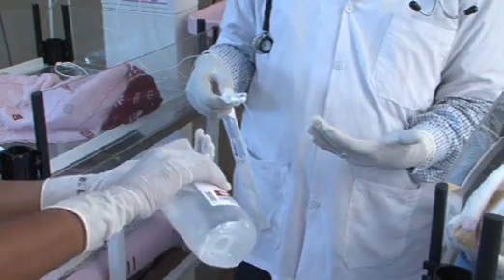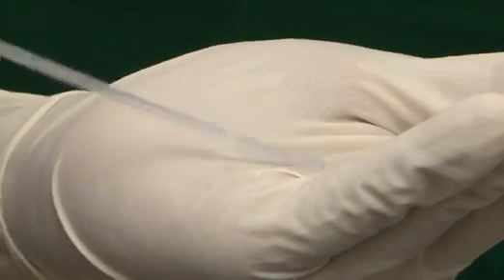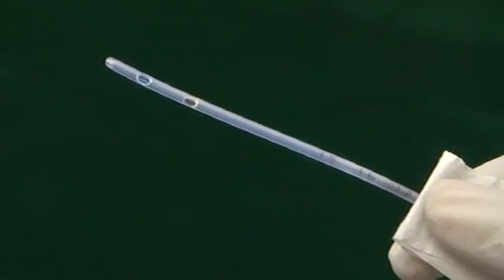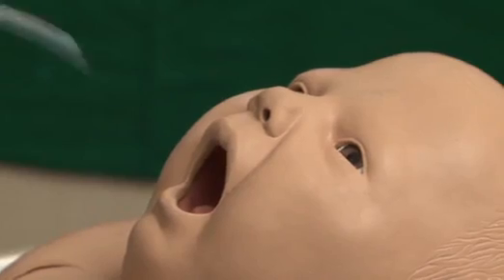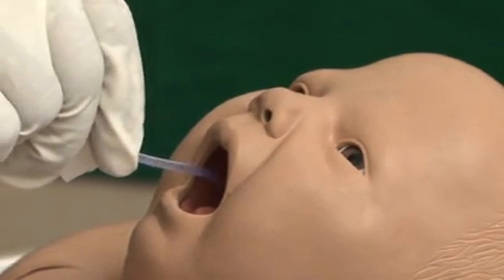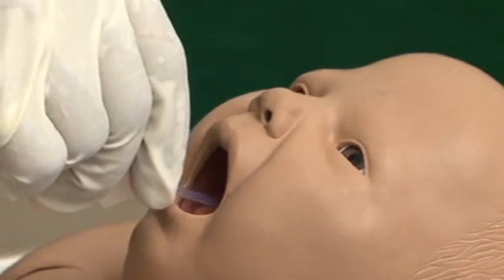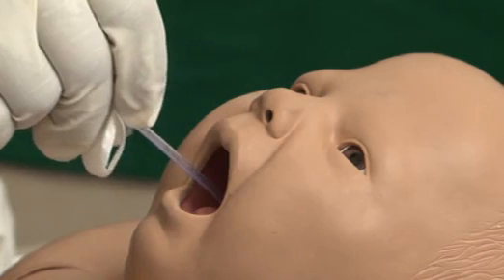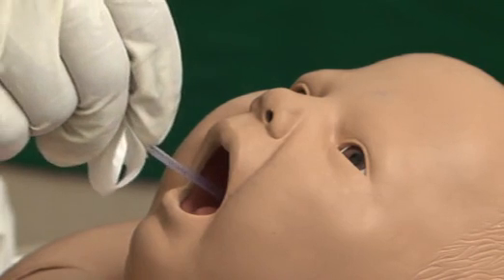Moisten the tip of the tube with normal saline. Hold the tube 4 to 6 centimeters from the tip and insert into the oral cavity pointing towards the back of the throat. Use the natural bend of the tube to insert the tube.